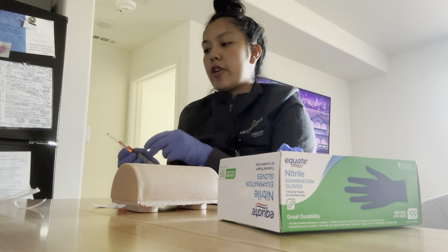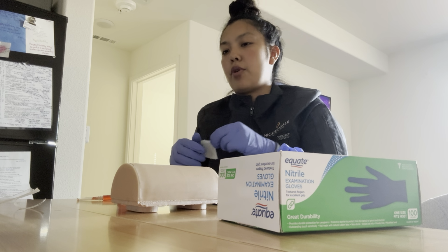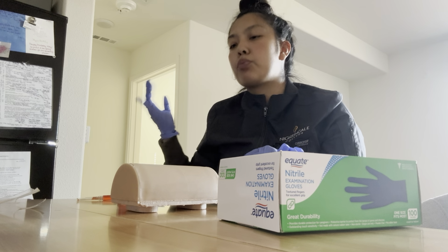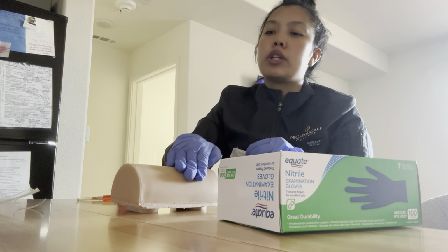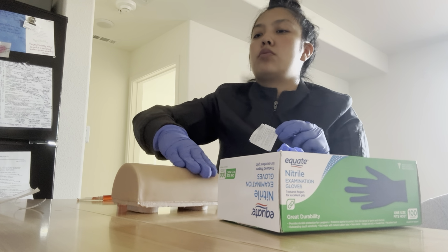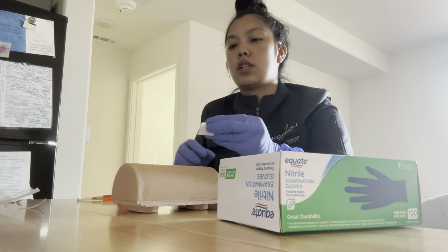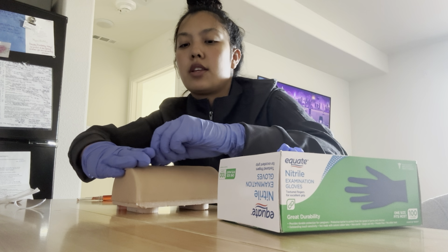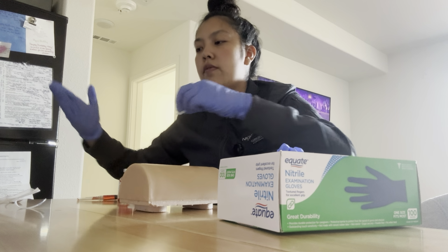Okay, now I'm going to put this down. Then I'm going to make sure that the patient's arm doesn't have any bruising, swelling, edema, or scarring that is going to make me not have a great injection. Okay, perfect. Patient is good to go. Going to locate my spot and then clean the site. Perfect.